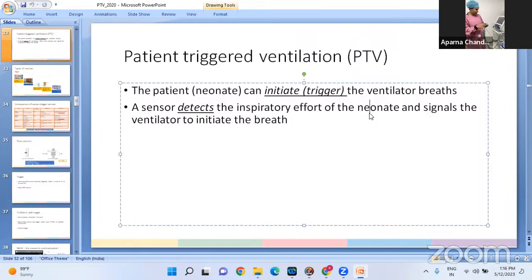And here comes the flow sensor. Whenever we remove the flow sensor, the ventilator will generally ask us whether it is okay to continue without the flow sensor. In the SLE 6000, we will see this type of flow sensor, which is a hot wire anemometer. You can see small electrical filaments of metal here. These filaments detect the drop in temperature when gas flows across the flow sensor, and this is the mechanism of measuring the flow. So this works on the principle called the hot wire anemometer.